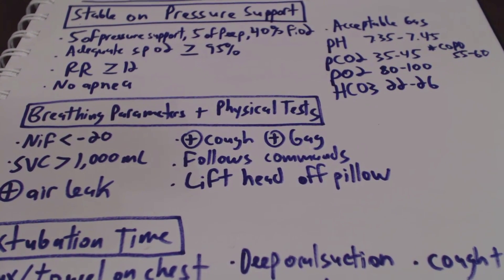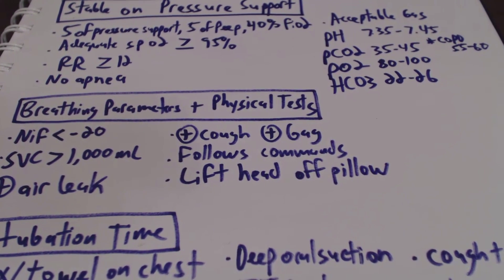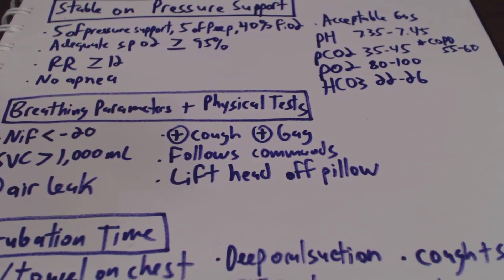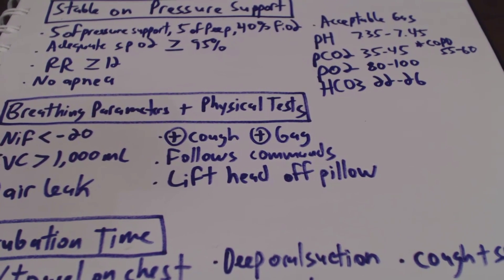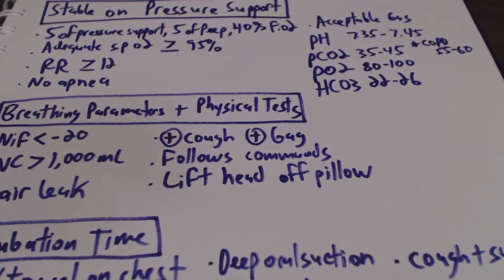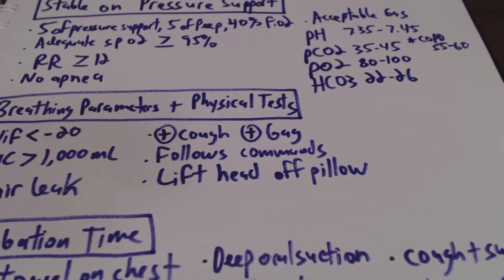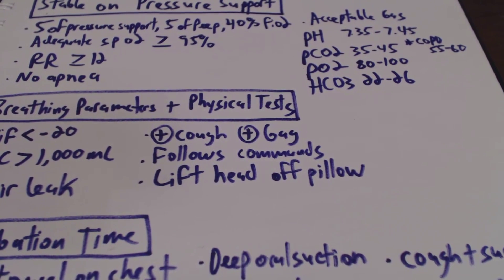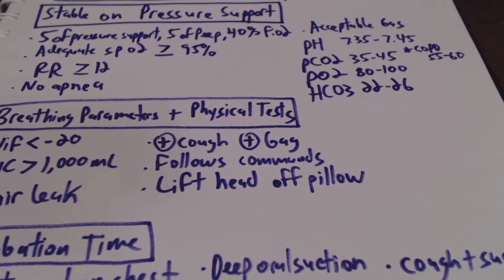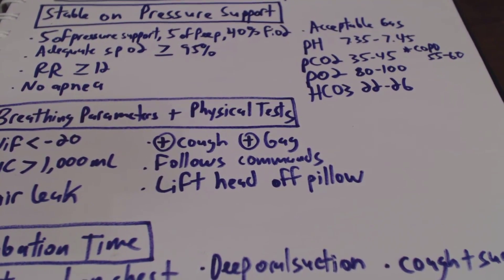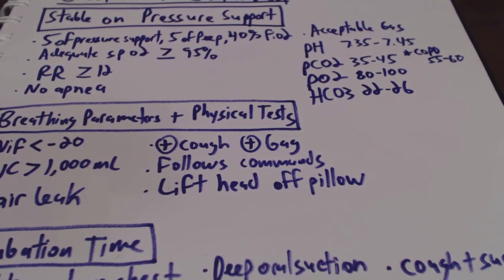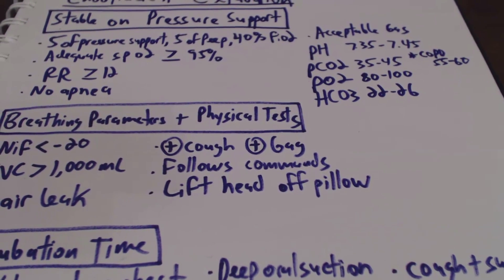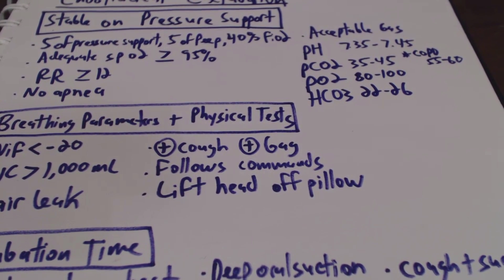We want to make sure the patient also has a positive cough and a positive gag. Now these are two different things that a lot of nurses and respiratory therapists use interchangeably, but they're not the same thing. A cough reflex is if you have an endotracheal tube and you have the inline suction, and you go in and suction them out and they're coughing. The cough is more of a respiratory response, and the gag is more of a gastric response, like vomiting. So if we take a Yankauer and stick it in the back of their throat, that is a gag. Although both can kind of go hand in hand, they're definitely two different things, and it's important to know the difference between the two.